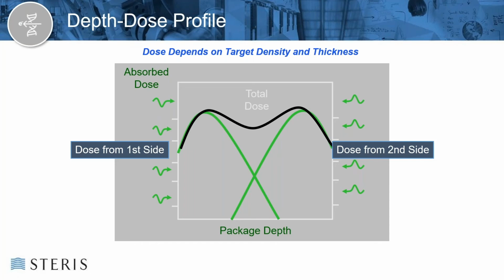And it looks like at the very edge on the left and right side, perhaps is about halfway up the chart. And in the middle, it peaks to maybe 3/4 of the way up the chart. So the dose uniformity ratio would be our max over our min, which would be those points on that y-axis, that 3/4 point over the half point.